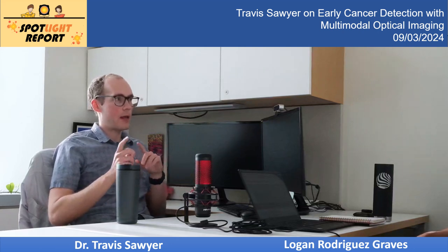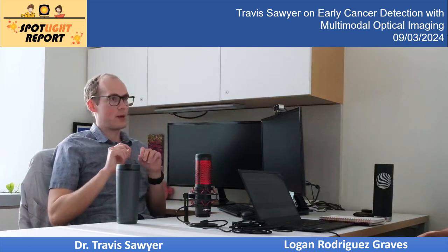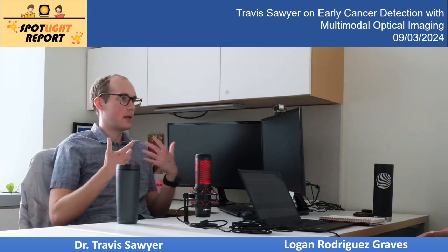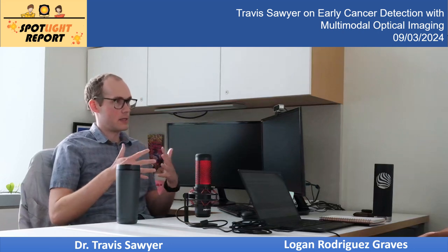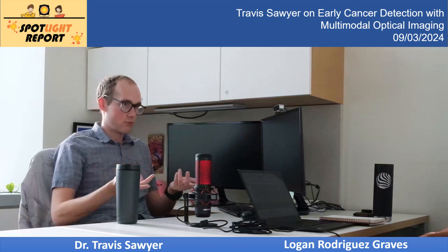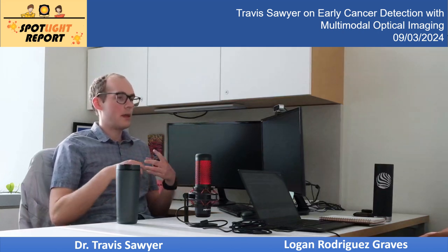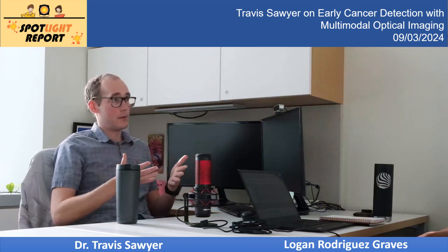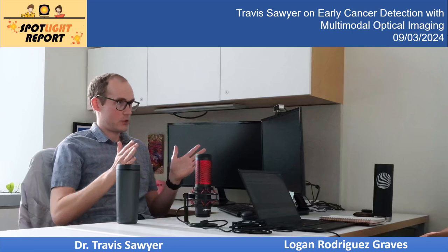The wavelength, however, that actually, the bandwidth of the wavelength defines the axial resolution, so it doesn't really matter at all what your optics are, but however broad your spectrum is, it's going to limit your depth resolution. The wavelength is really important for penetration depth, and so if you're working with fresh tissue or living tissue, you're going to have a couple of absorbers that really limit the window in which you can work.